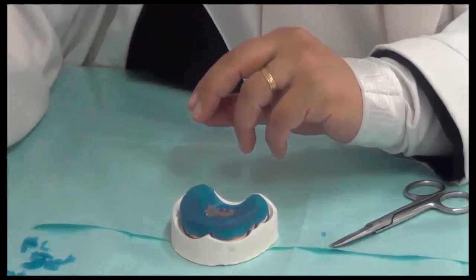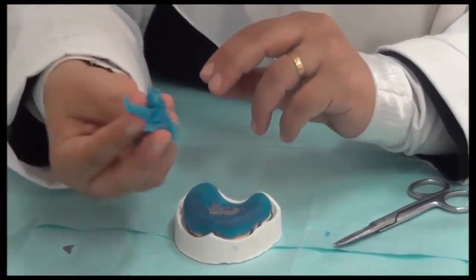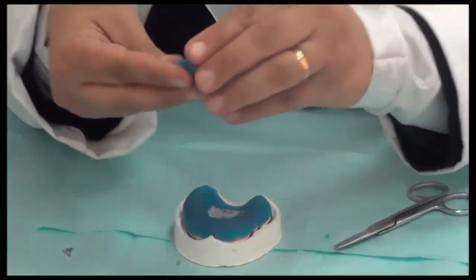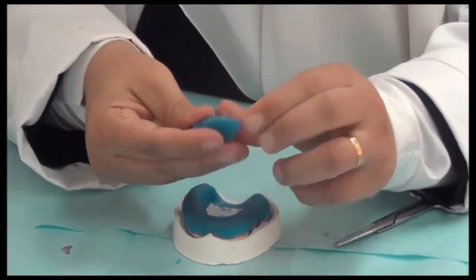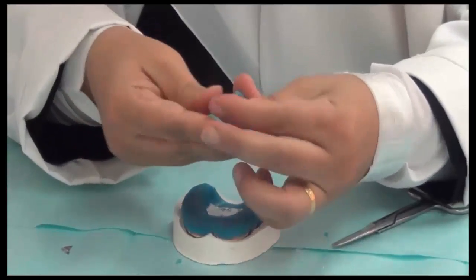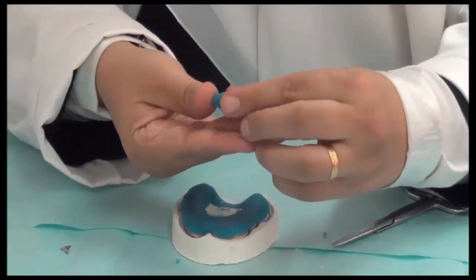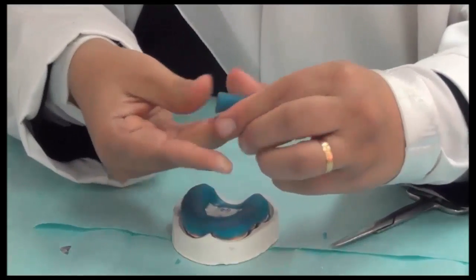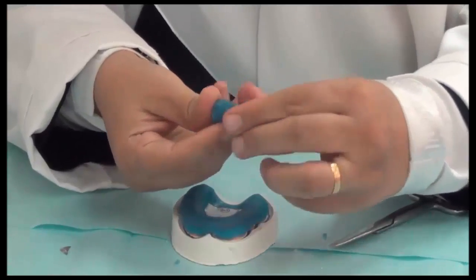For the handle, we can take the excess that we had and mold it into the form of a roll. Okay, we press the excess from one side, so we roll it and it will have this shape.